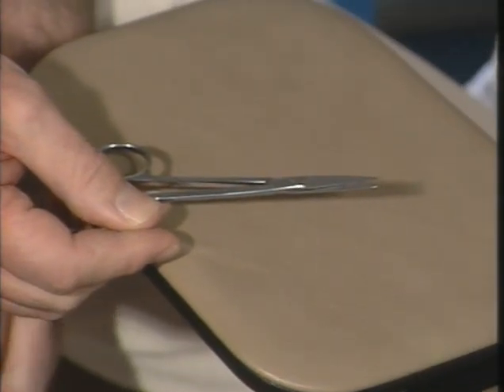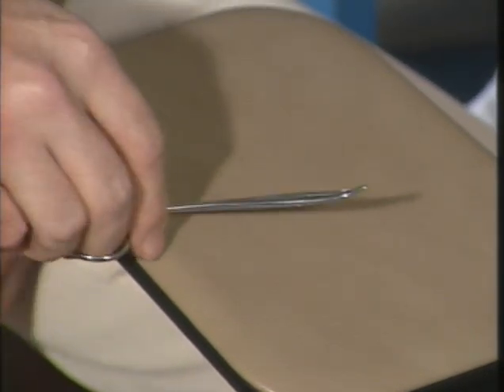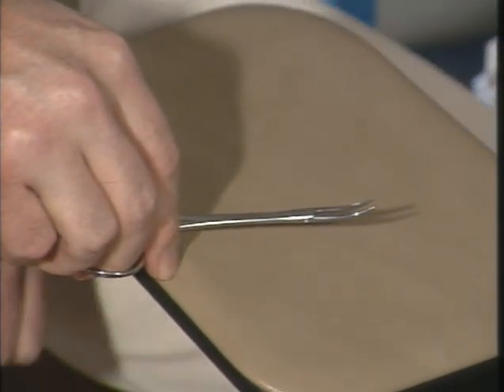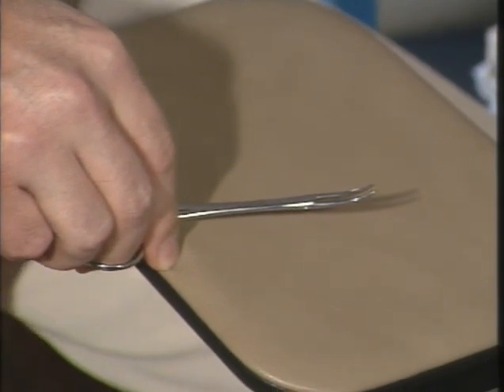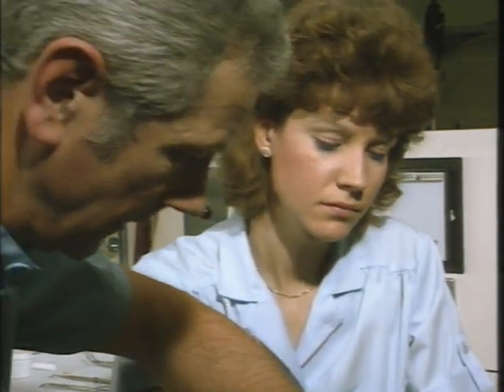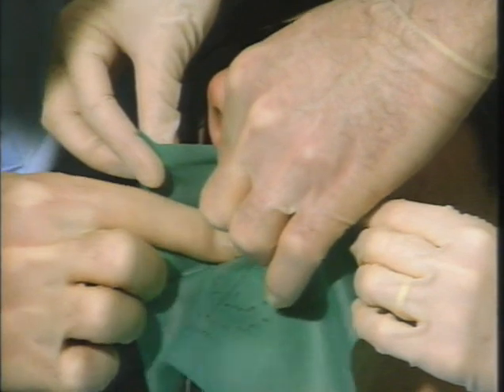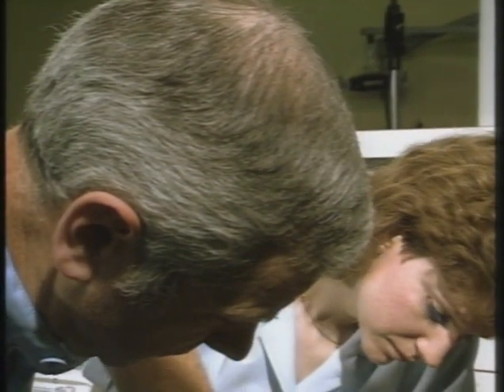You may also find that you need to use some scissors, and it's better if these are blunt nosed so that there's no damage to the patient's soft tissues. And you may require to have some mosquito forceps. They can sometimes aid also in the placement of the wooden wedge, but are very useful for removing the wedges when the operative procedure is finished. And last, but of course not least, is the dental surgery assistant. She is essential in the preparation of the patient, in providing an extra pair of hands that speed up all the operative procedures, and in helping to ease the rubber dam between very difficult contacts.